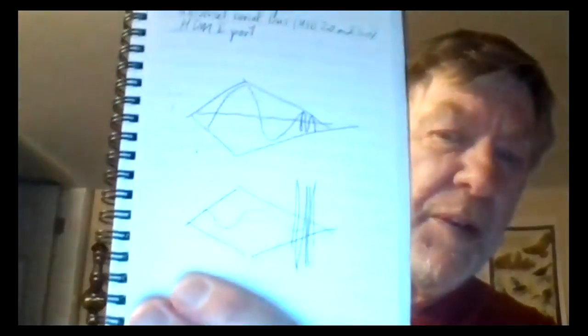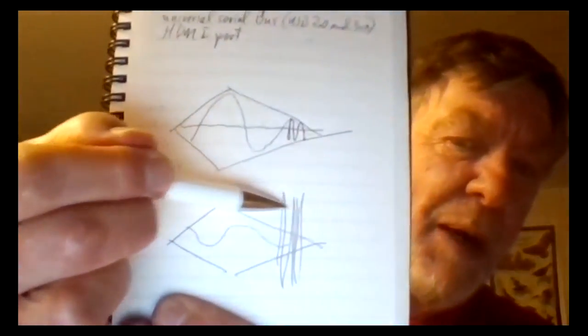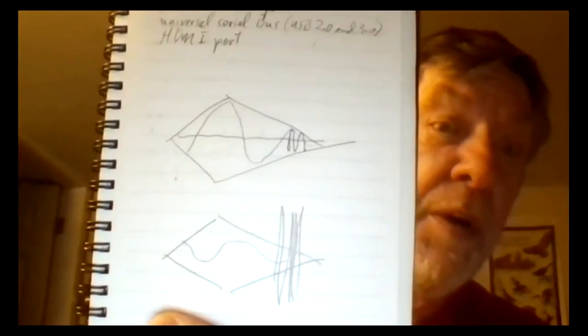But I can make that peeping high frequency canary, I'll draw another little kite here, as loud as I want to, but it's not going to come out here and mask the low frequency tone. Upward spread of masking. It's called audiological checkmate. Can't do anything about it.